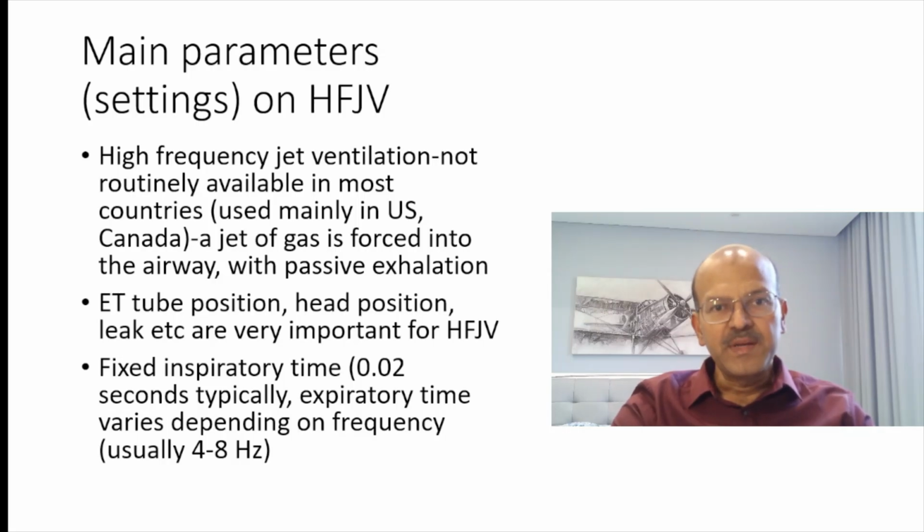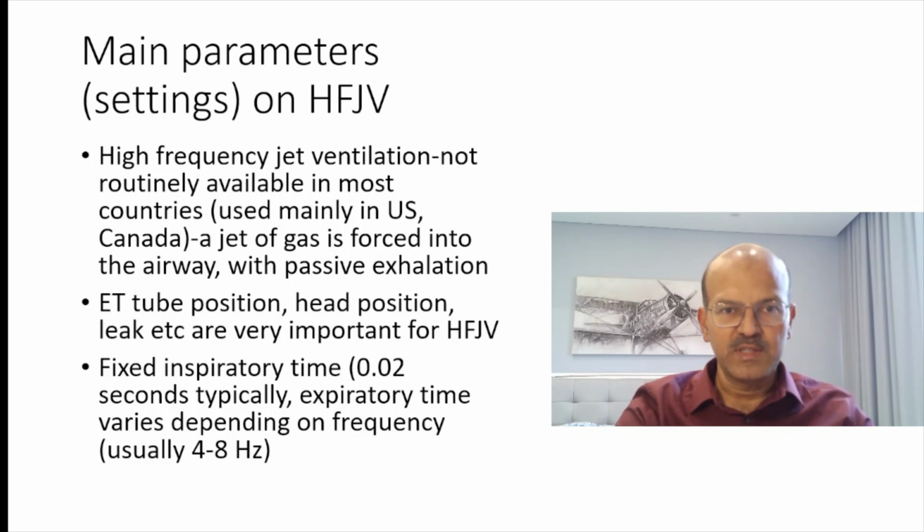So what are the main parameters on high frequency jet ventilation? As I said, we won't discuss much about jet ventilation because we don't use it in most of the areas where I would be covering here. So it's not routinely available in most countries. It's used in US and Canada.